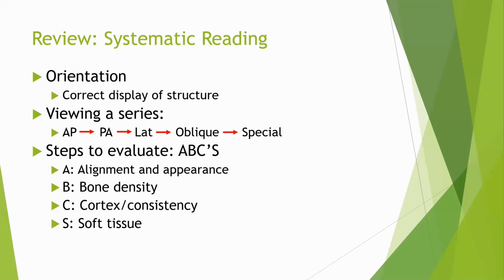So, systematic review. I am a huge proponent of systematic review. Don't read in a hodgepodge. You may understand, you may not understand everything in total. You should have a set rule in your own mind that, step by step, I need to advance reading the x-rays according to what I think is justified. That will help my conclusion, and that will give me a better understanding and judgment of the diagnosis from a clinical standpoint after reading the x-rays.